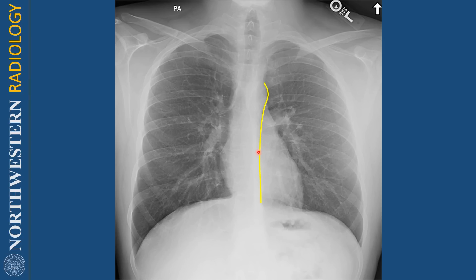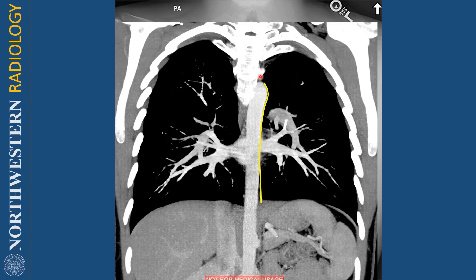We'll talk more about that concept when we talk about the silhouette sign in class. Here's the corresponding CT image showing the aortic arch and the descending aorta. It's important to remember that the descending aorta is a posterior structure in the chest.